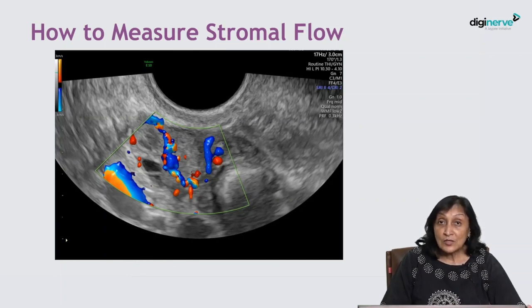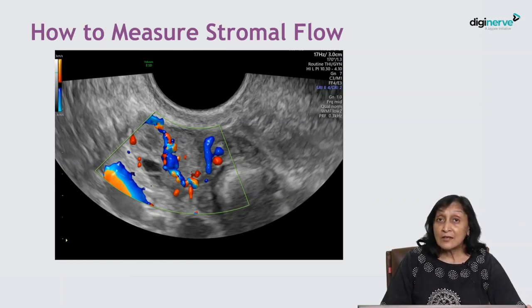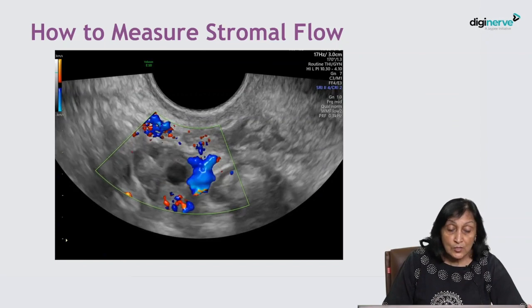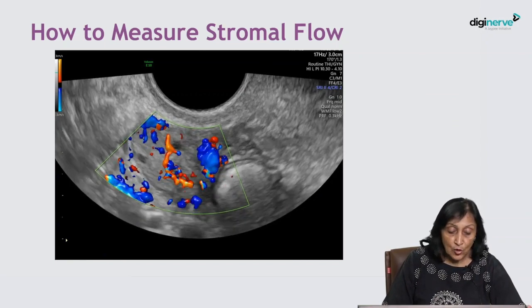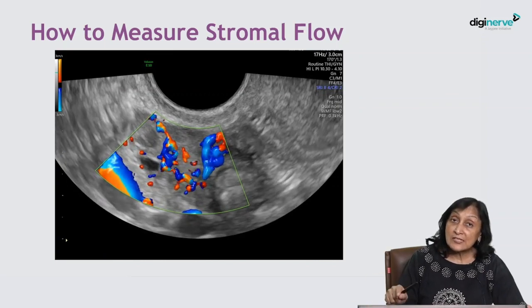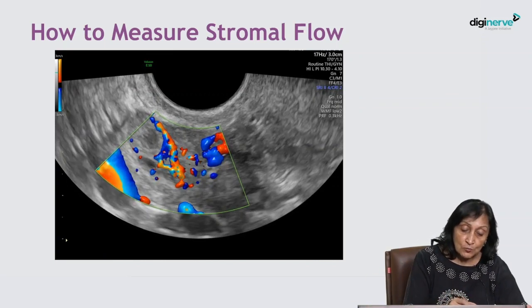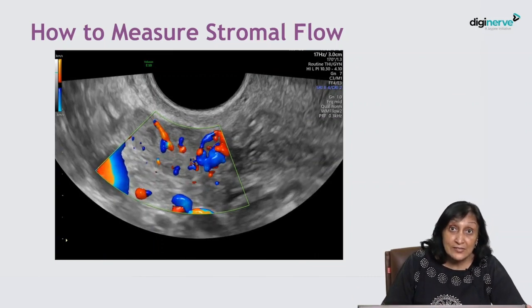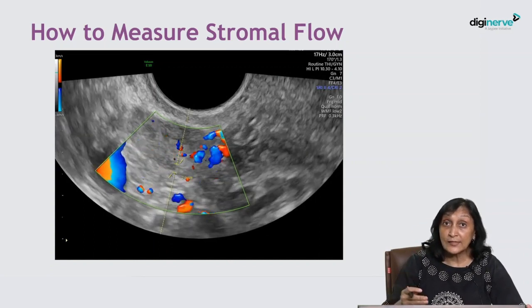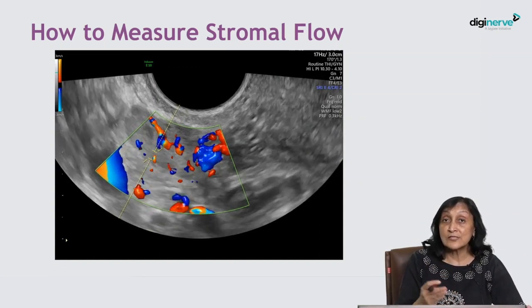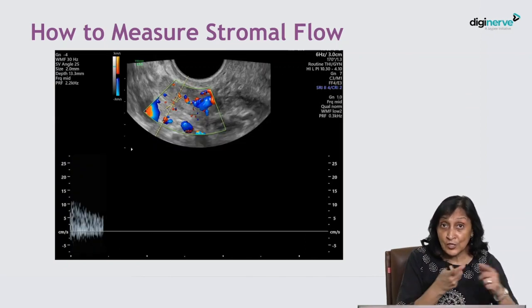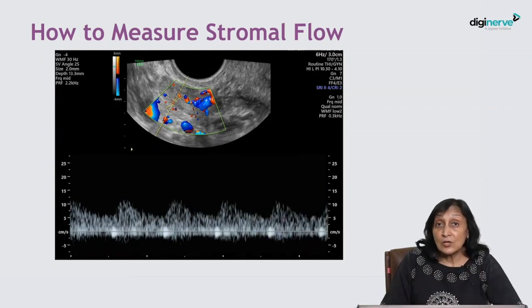Once you locate the ovary and switch on the color box, the color box should be large enough to include the entire ovary. Then as you see the color, you scroll across to find a vessel in the long axis which can be traced outside the ovary — meaning it is a vessel entering the ovary from outside, which means it is an ovarian artery or an ovarian branch of the uterine artery, or sometimes both, as you can see here, may be intermingled. That plane is called the hilar plane.